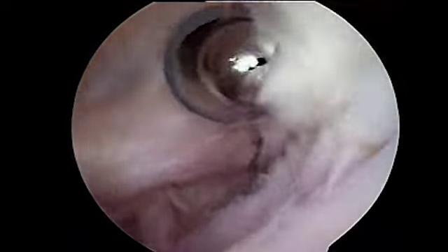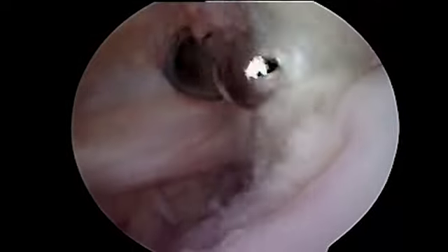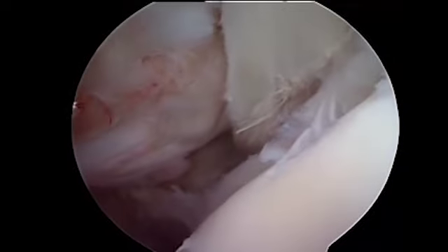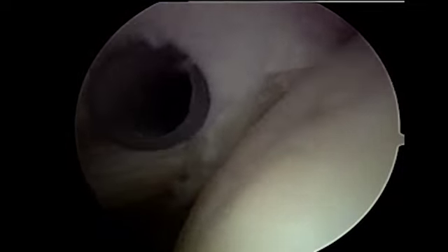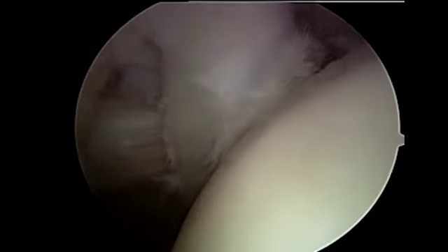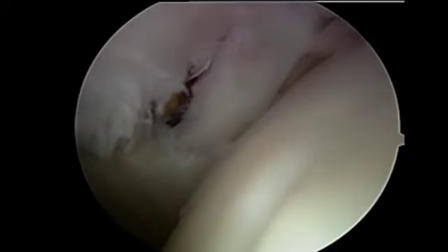In fact, in this example, when we debride away the last restraining structures, which in this example is the superior glenohumeral ligament, we can watch the biceps spontaneously dislocate into this defect created by the absence of the subscapularis. In this most unstable example, we can see a large subscapularis tear and completely vertical orientation as noted upon entry arthroscopically.